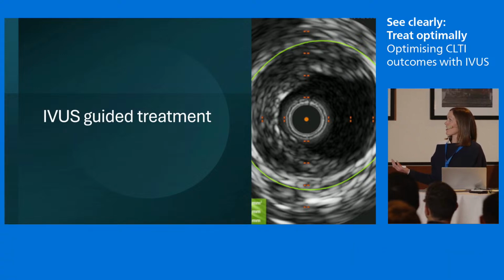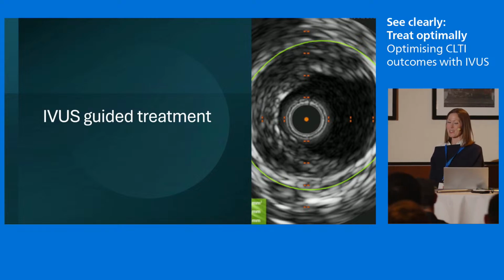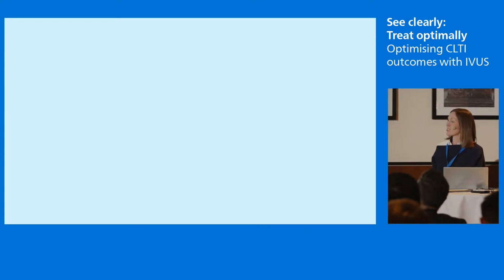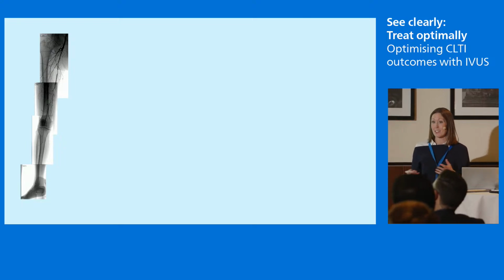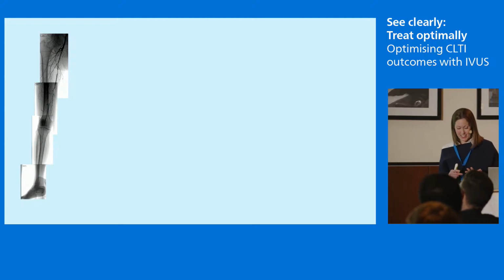So just to end on a slightly higher note than that. Absolute failure. This was a case that we did very recently where we've used IVUS the whole way through. So again, SFA pop, I'm sorry that it's all boringly SFA pop, but for me this is the most challenging segment to treat. So again, I must clarify this case before I carry on.